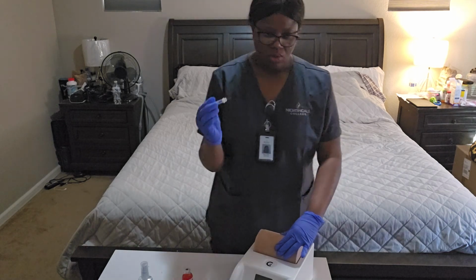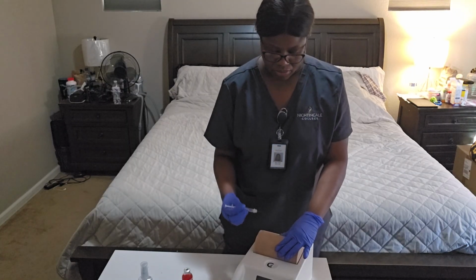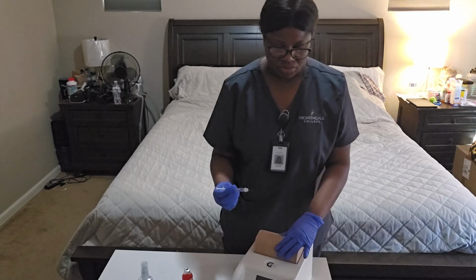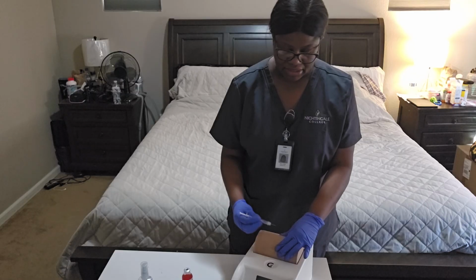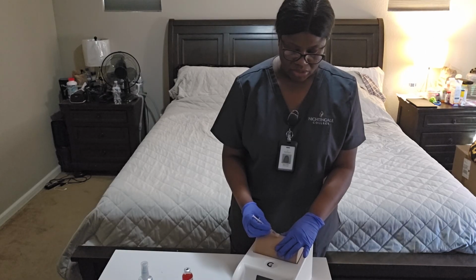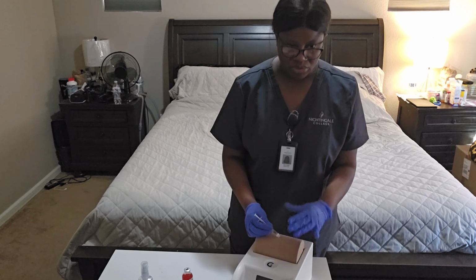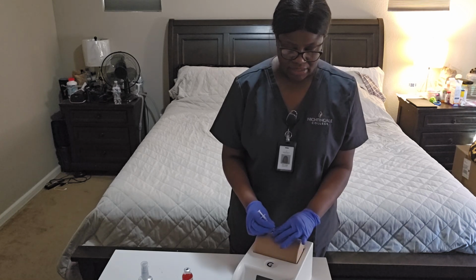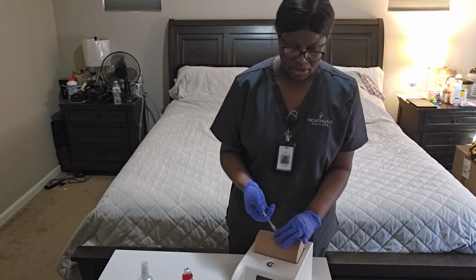Okay, with the bevel up, I'm going to put it in at a 5 to 15 degree angle. Okay, 5 to 15 degree angle, I'm going to go in about 3 millimeters. I'm not going to go in too deep. Then I'm going to stabilize it. When it's stabilized, I'm going to use my non-dominant hand to hold it, and I'm going to push in the medication.